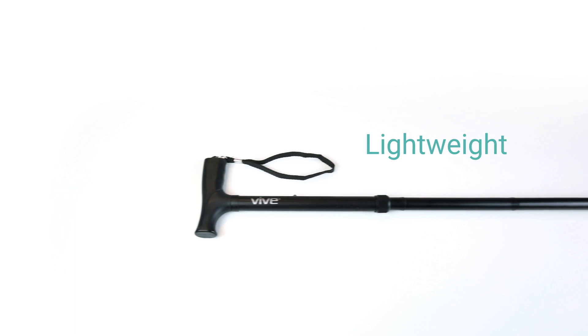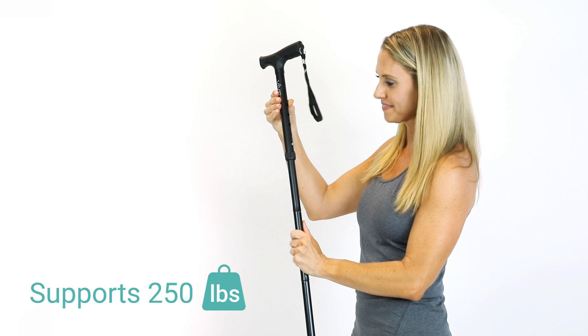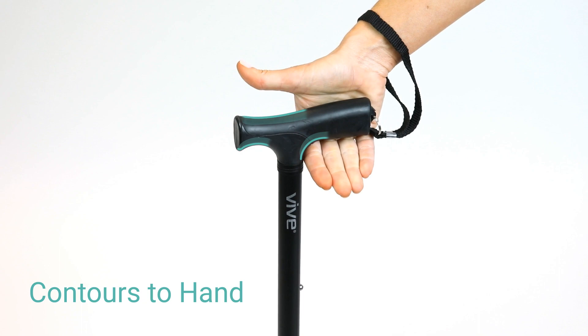The adjustable anodized aluminum frame is lightweight and durable, supporting up to 250 pounds. An attached wrist strap prevents the cane from falling when released, and the gel handle contours to the shape of your hand for all-day comfort. It's also capped with a slip-resistant rubber tip for additional traction.